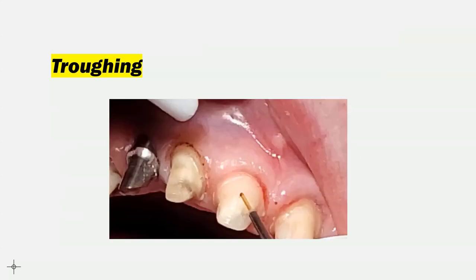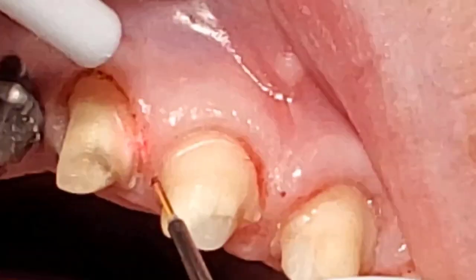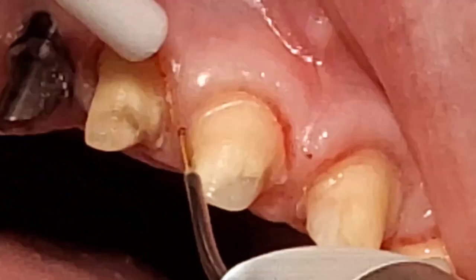Let me take you through this video a little bit, and you'll kind of see here, I was going to drop the finish line to where I created my trough, but I'll give you some idea with the diode. The patient is anesthetized, and you'll get to see how the tissue is removed. This is using the 810, Gemini, 810, 8/10 of a watt.